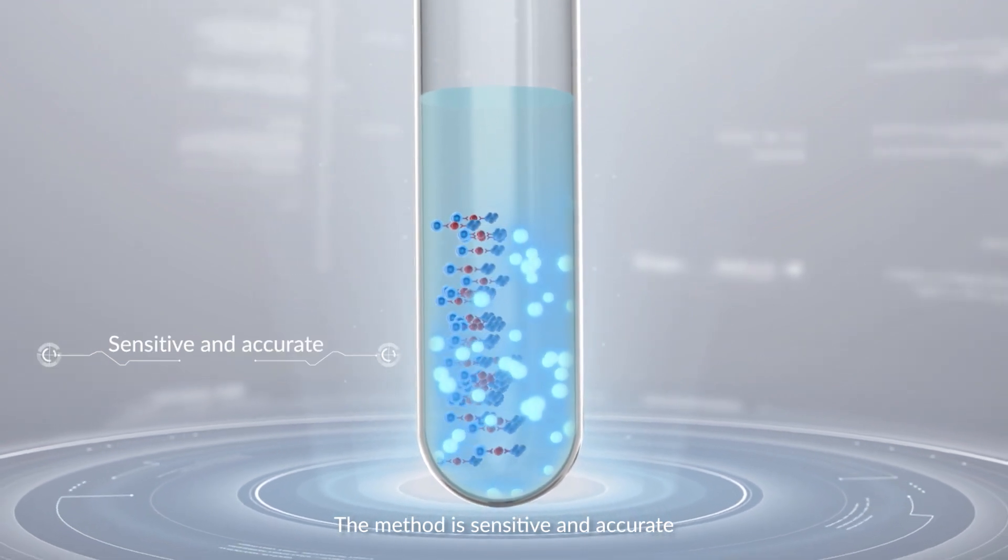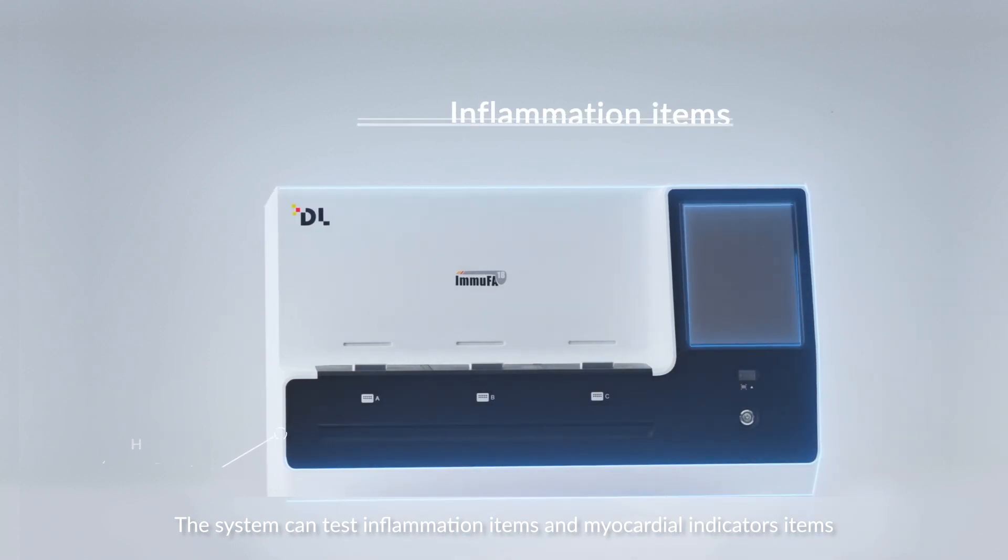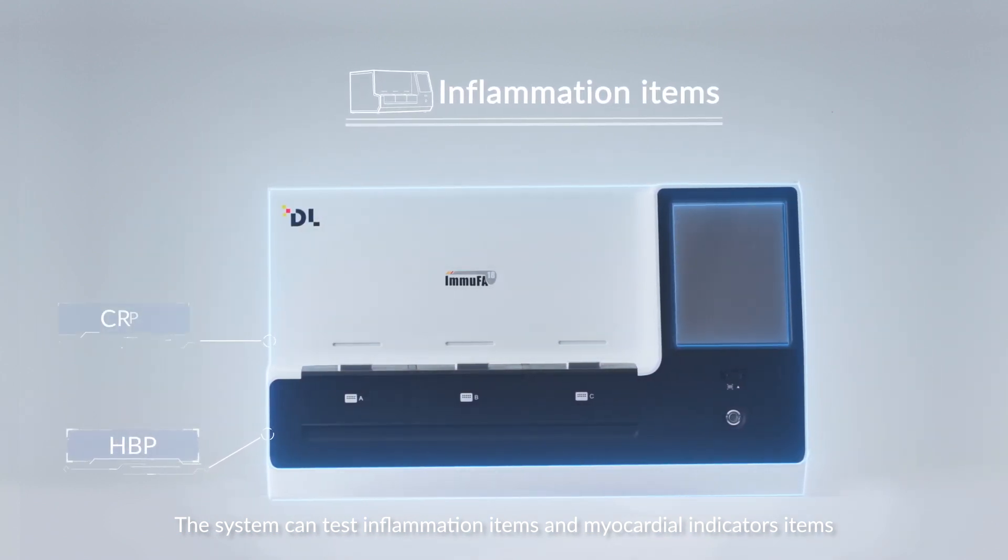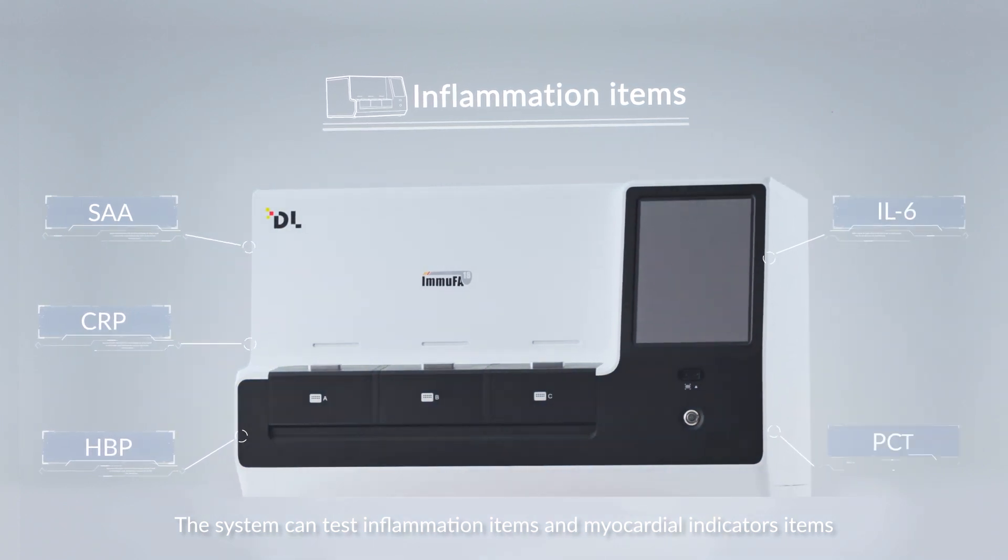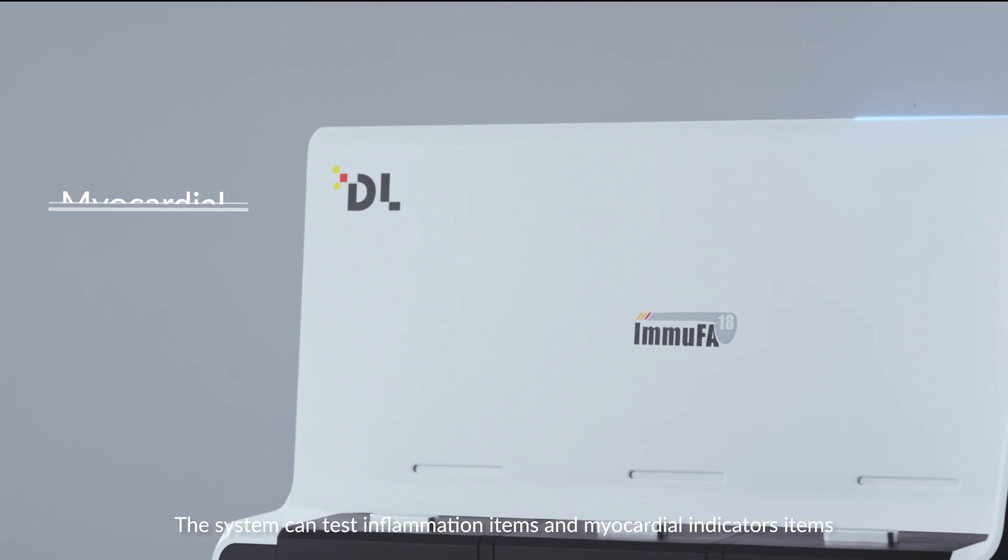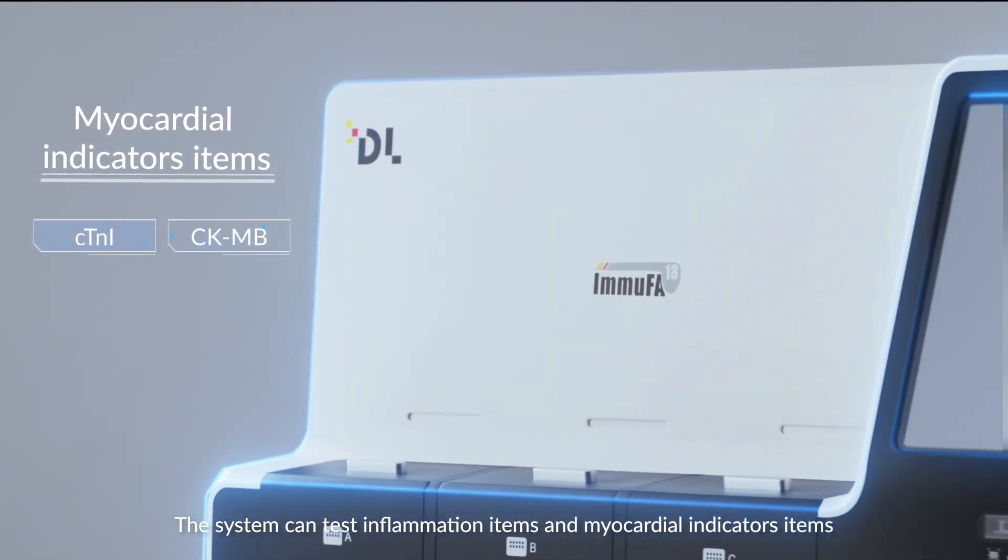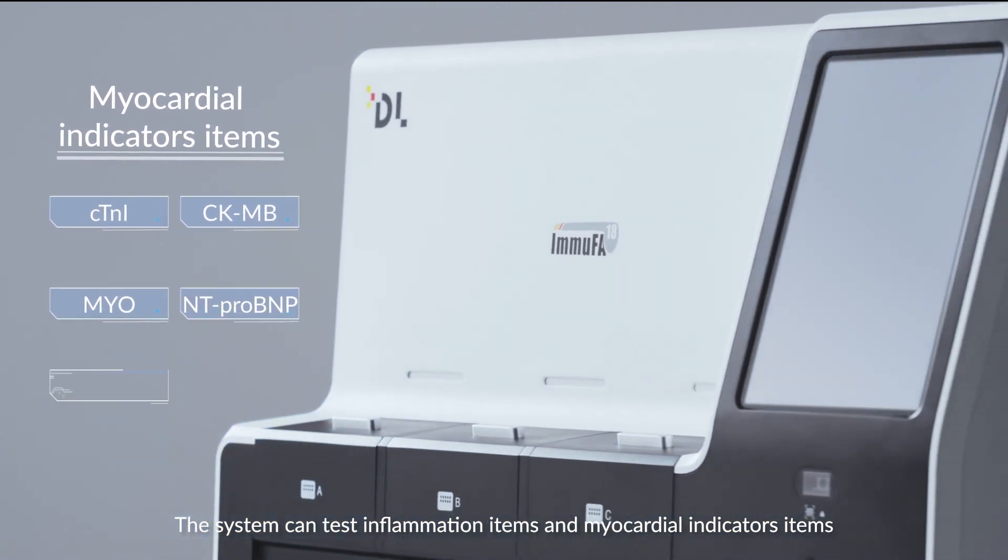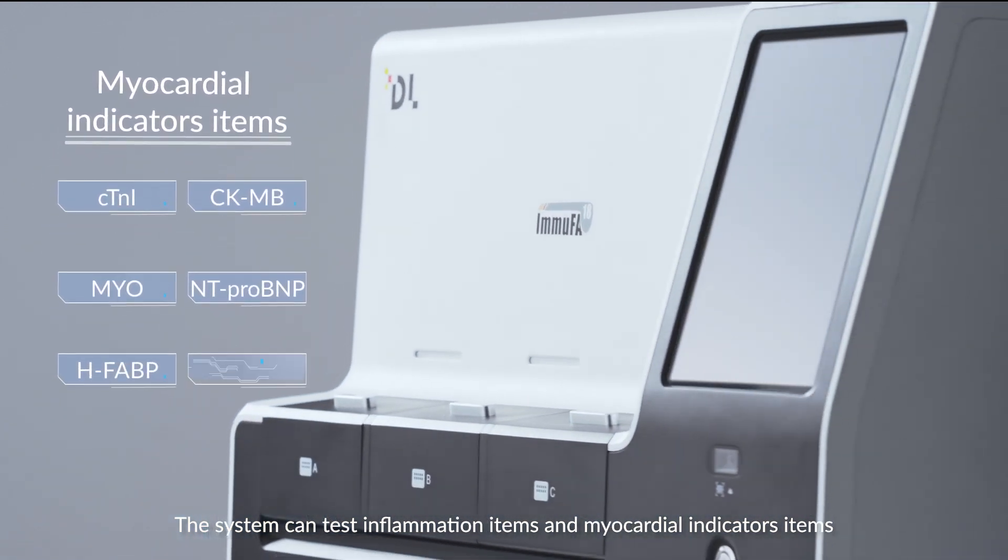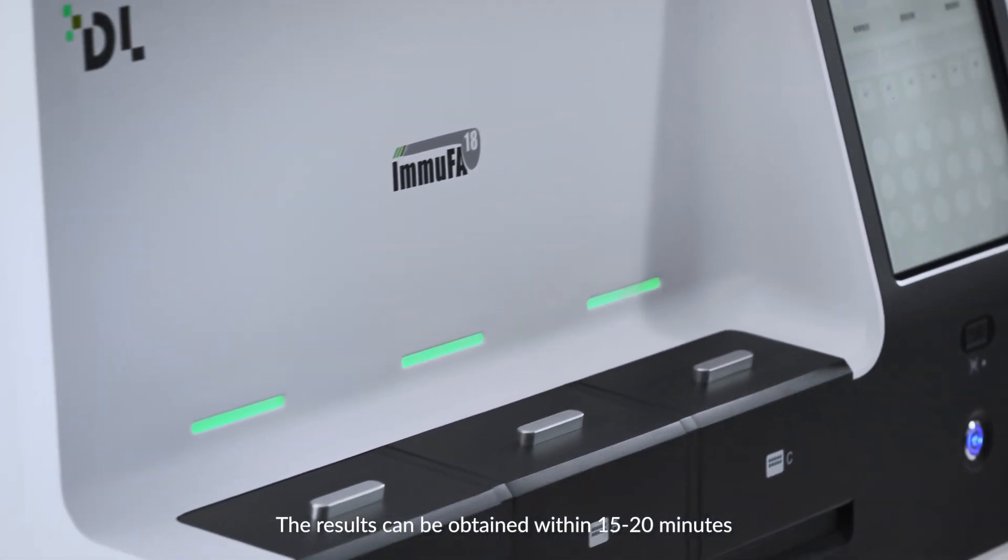The method is sensitive and accurate. The system can test inflammation items like HBP, CRP, SAA, IL-6, PCT, etc., and myocardial indicators including cTnI, CK-MB, MYO, NT-proBNP, H-FABP, and D-dimer. The results can be obtained within 15 to 20 minutes.